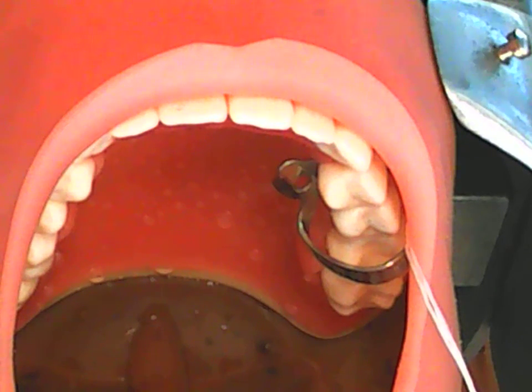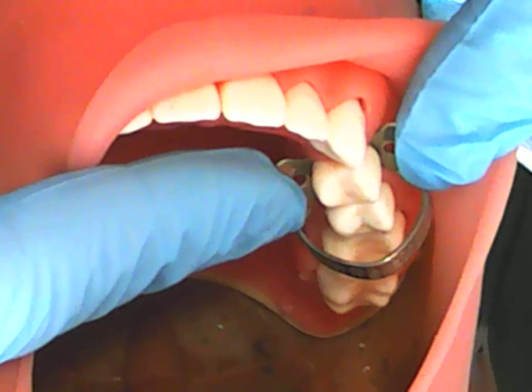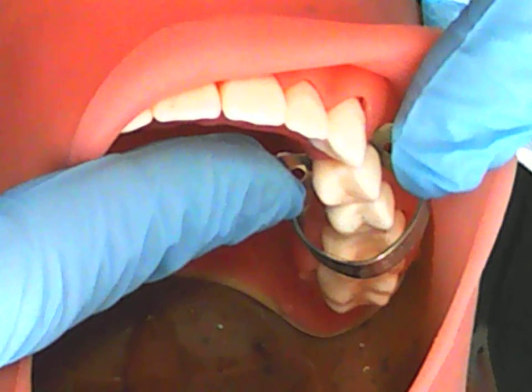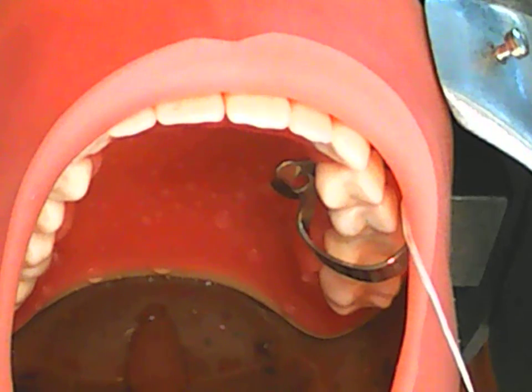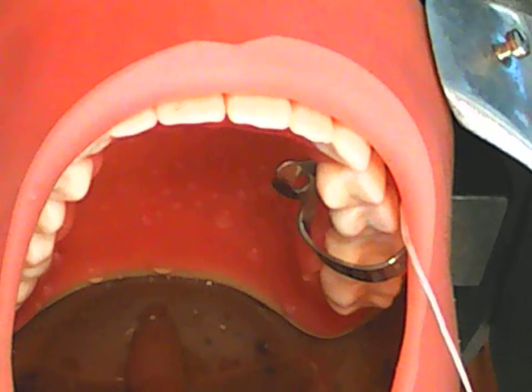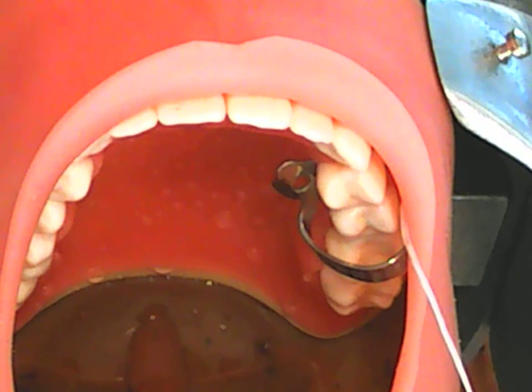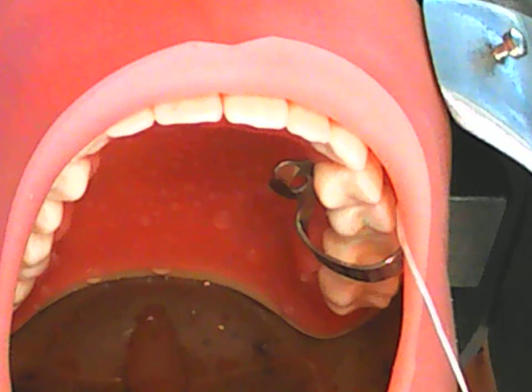Before proceeding, I want to ensure stability of the clamp. So I'm going to rock it back and forth. It's fairly stable, check your bow, and it's not moving. So that's a stable clamp, and that's what you want. If it is unstable and moving around on you, you would want to try a different clamp. You may want to get a new clamp because sometimes the clamps get stretched from using them a few times over.